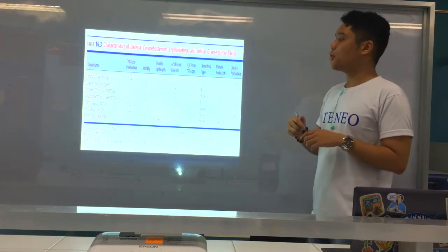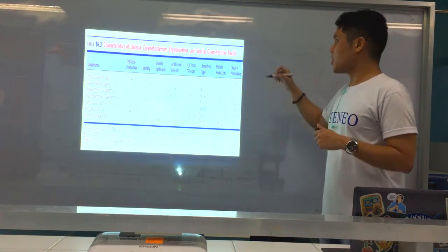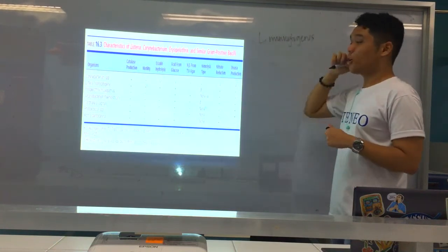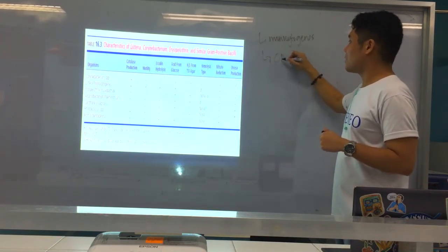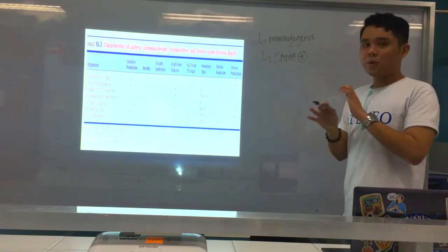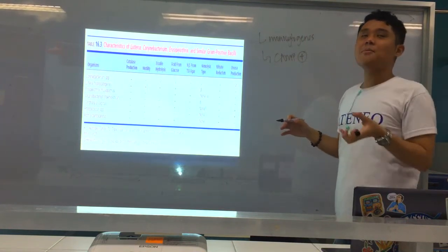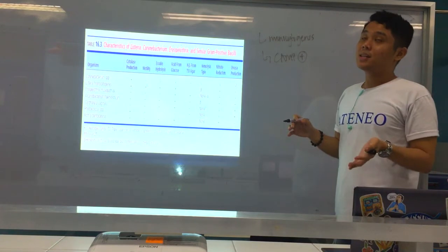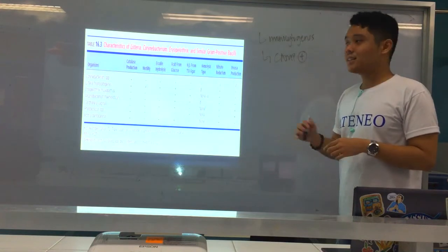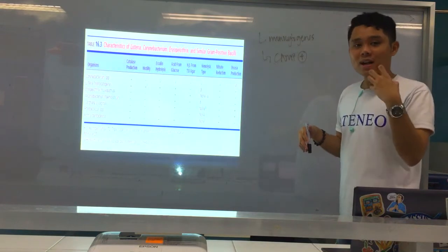Okay, alright. Listeria monocytogenes, guys, please take note, it's esculin hydrolysis positive. Okay. Listeria monocytogenes, if you can recall from our biochemical testing for Streptococcus, it's also CAMP positive, remember? Okay, CAMP positive together with S. agalactiae, right? So, usually, they can be confused, but you don't have to confuse them because, if you ask, sir, if I have a CAMP positive reaction, it could be Listeria or Streptococcus. So, how do I differentiate them? Don't worry. Easy. Gram stain lang. Listeria is a bacillus and Streptococcus agalactiae is a cocci. So, right here, you can already differentiate the two.